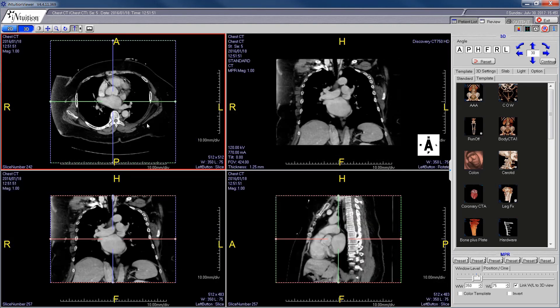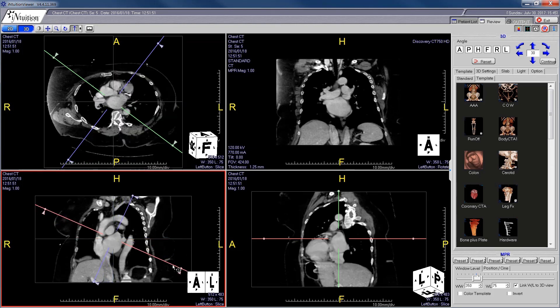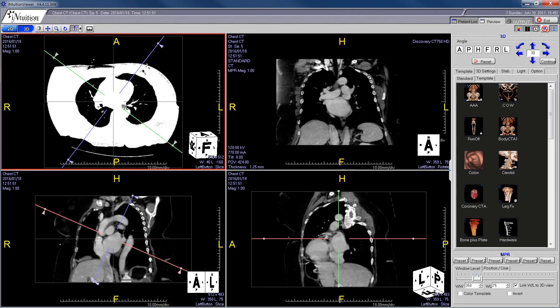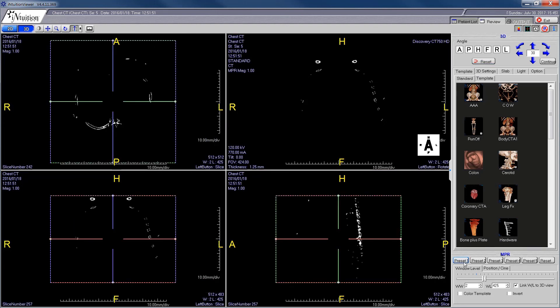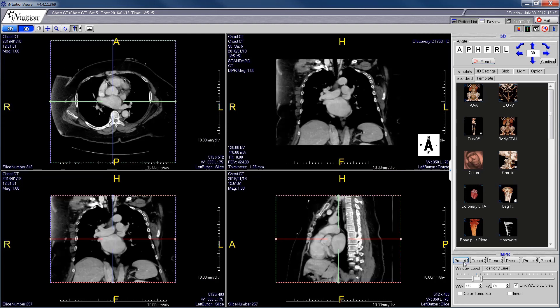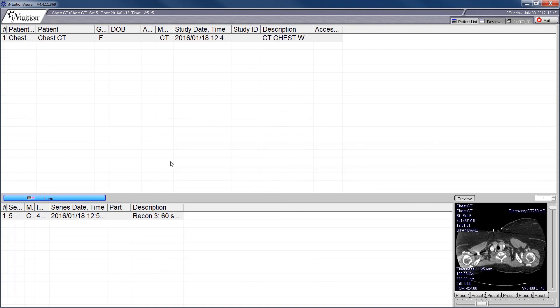If you are browsing through the CT and you accidentally rotate the image in the axial or coronal plane so it's off-axis and incorrectly windowed, you can always reset the image and then go to your preset — soft tissue, lung, or bone — to get back. Alternatively, you can return to the patient list and double-click on the chest CT again to reload it.